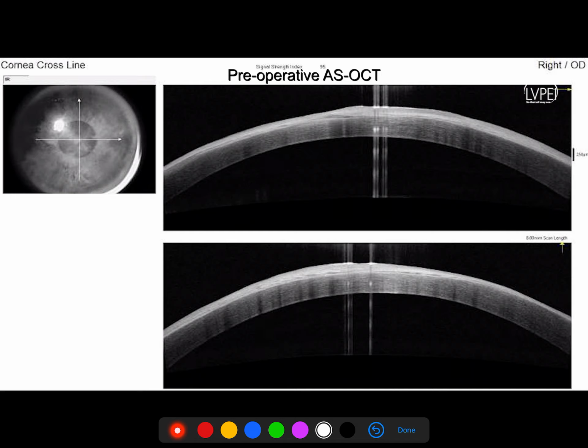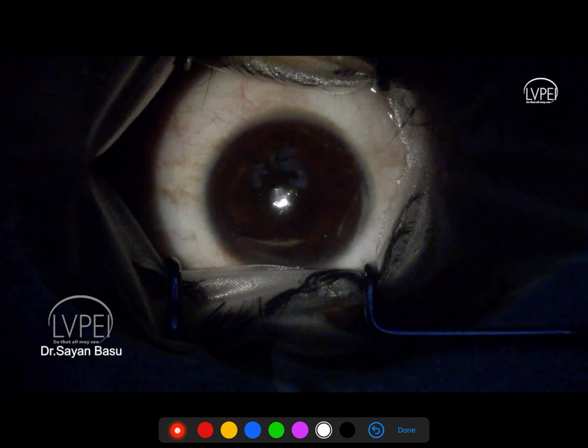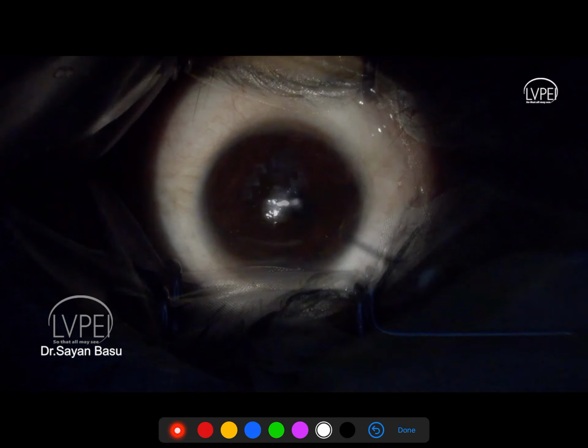All right. So having said that, we can now move on to the surgery proper. When I am doing a limbal biopsy, I am usually doing it under topical anesthesia, and therefore you will see that during the biopsy my illumination is only set in retro. It's not very bright. The patient has not been blocked in this eye. This is an adult patient. Of course, if you're doing surgery in a pediatric age group, then it's on a general anesthesia, but here it's an adult patient under topical anesthesia.